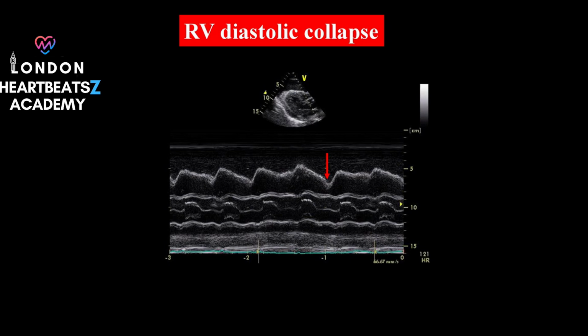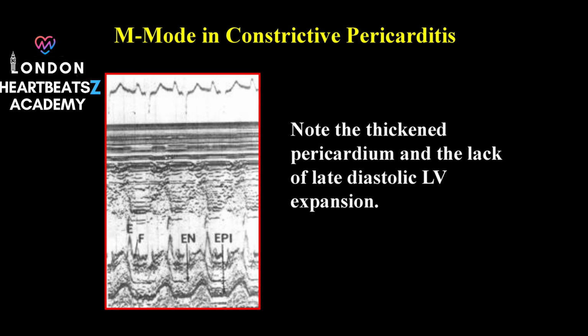It is. And this is just one example. M-mode can also be combined with color Doppler to create what we call color M-mode. Color M-mode, what's that all about? Color M-mode takes the depth and motion information of traditional M-mode and adds the dimension of color Doppler, which shows us the direction and velocity of blood flow. It's a powerful tool for visualizing blood flow patterns within the heart.